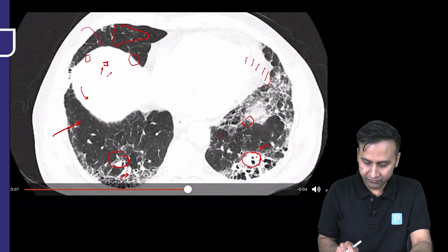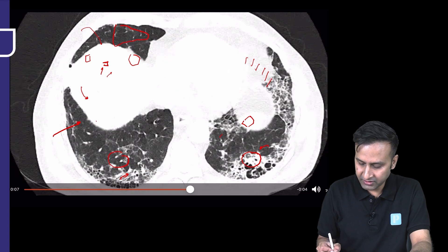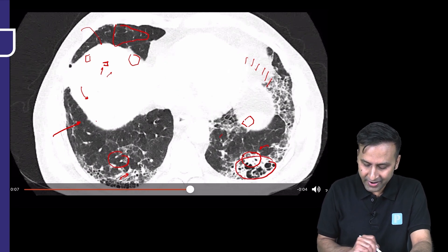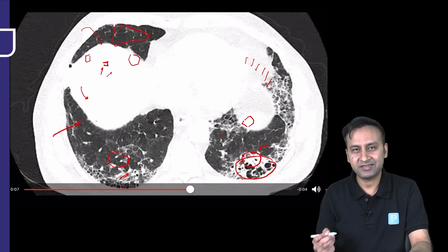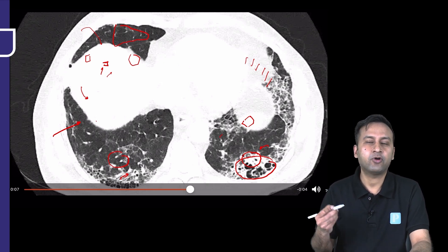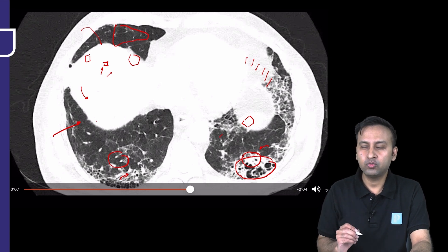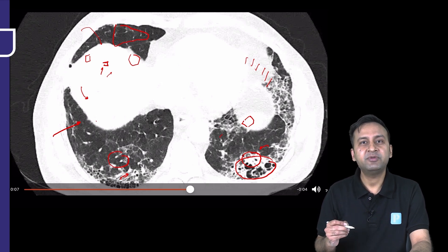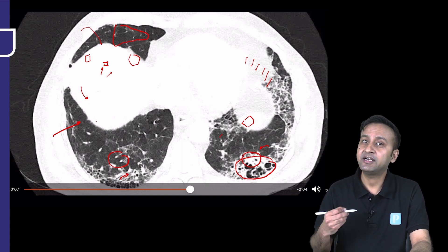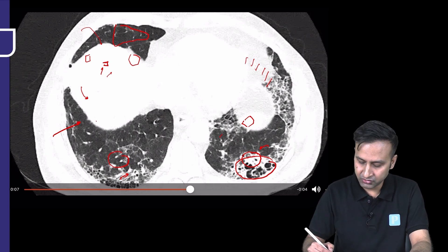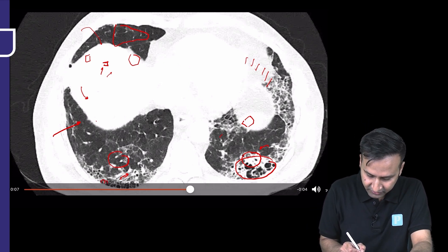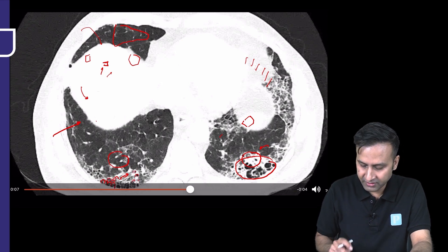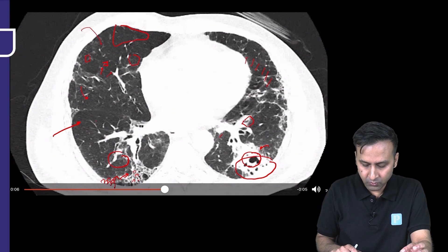Going further down, the diagnosis is becoming certain. There are multiple honeycomb cysts present. These are honeycomb cysts because — as we discussed — honeycomb cysts are multiple thin-walled cystic areas located in the periphery, with shared walls, seen in multiple layers extending from the pleura inward. You can see multiple stacks of layers one over the other. This is definitively honeycombing.